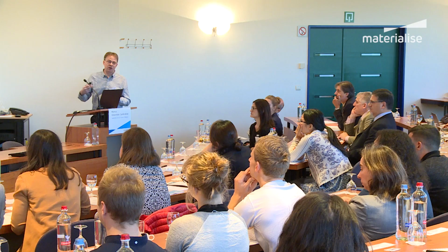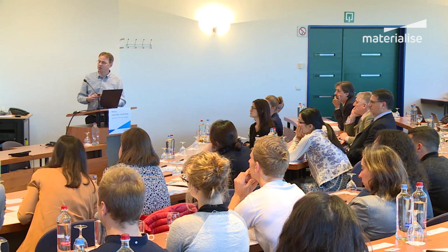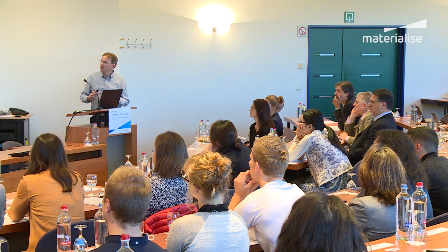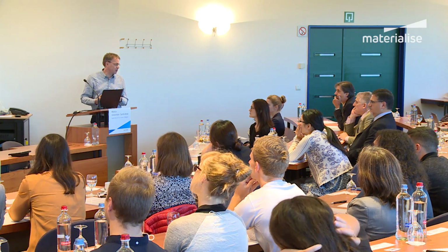Another example is the assessment of the growth of a low-grade glioma. So we're looking for an acceleration in the growth because this is a good indicator that the tumour is transforming and becoming malignant. And these patients are monitored every 3 to 6 months.